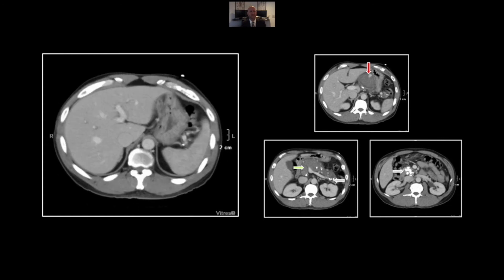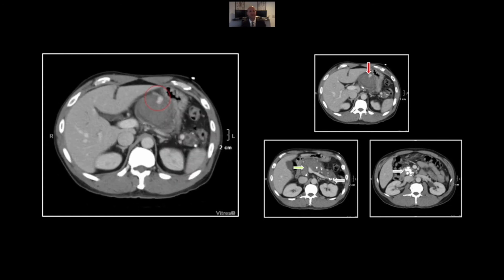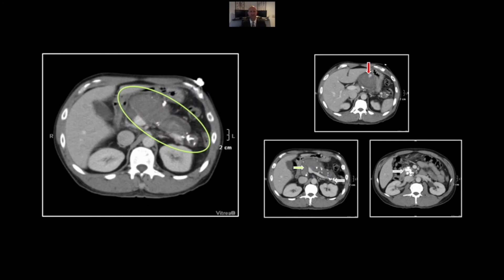That is an acute hemorrhagic pancreatitis superimposed on chronic pancreatitis.